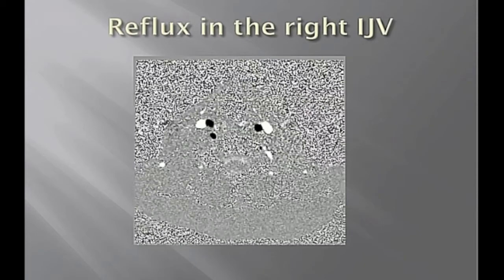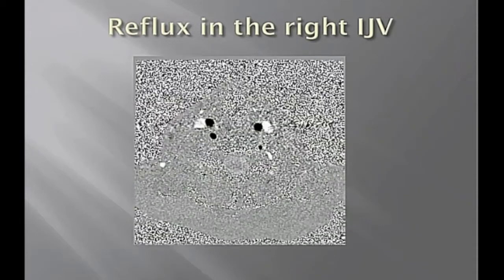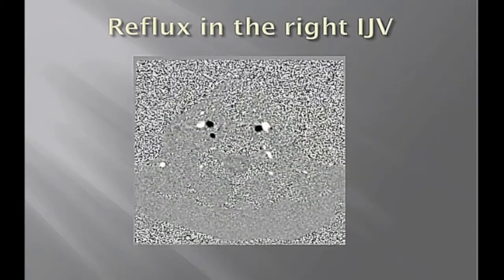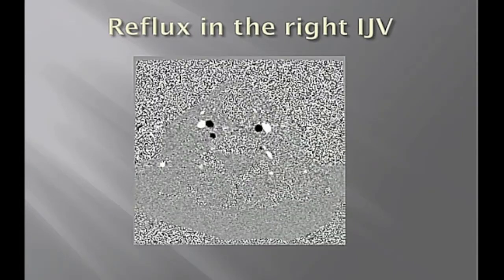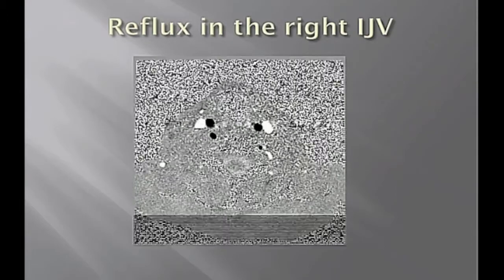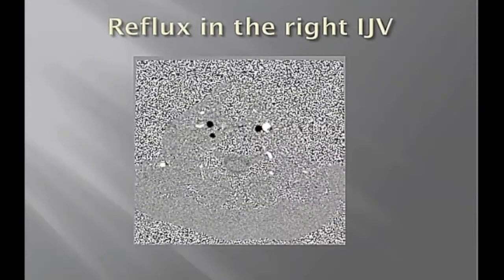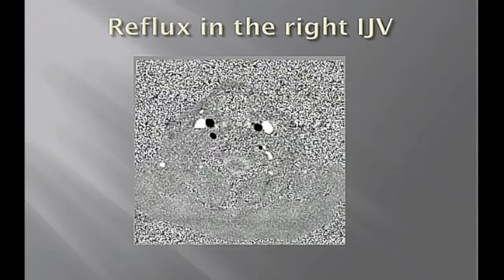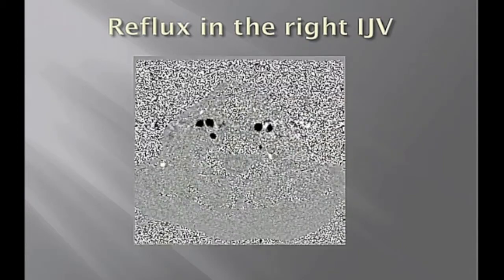Now I want you to look carefully right here. Watch that turn black. Now this may not repeat many times, so again, watch that turn black. Same over here. But black means going toward the brain. So the bright white was the internal jugular vein flowing down towards the heart. And all of a sudden, it stopped. And it went backwards. Exactly the reflux that Zamboni was talking about.